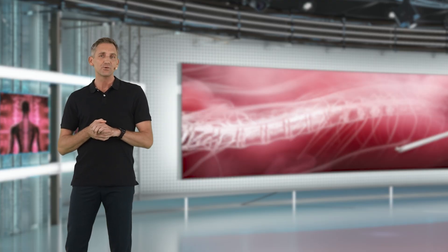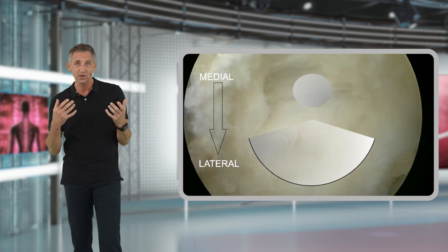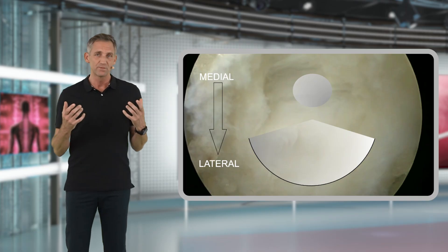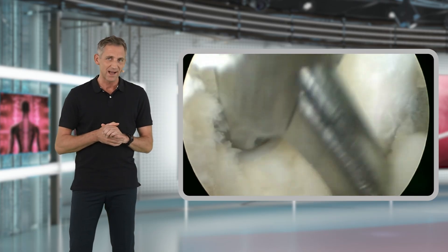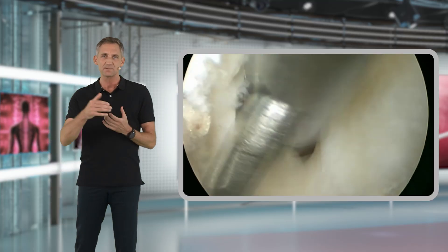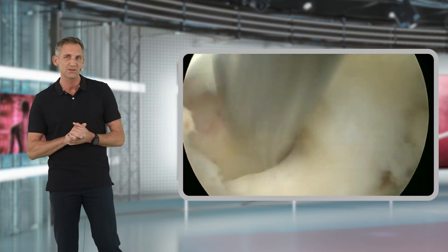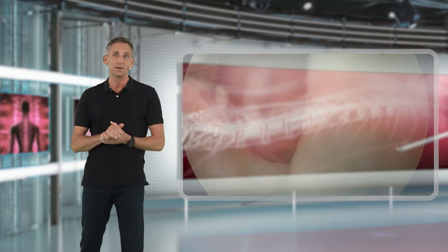In case you are doing an over-the-top decompression, the yellow ligament is one of the main components of our pathology and therefore needs to be removed completely. You can do so by either cutting through the yellow ligament centrally with scissors, as described in our previous chapter on endoscopic discectomy, and then continue your yellow ligament resection from there.